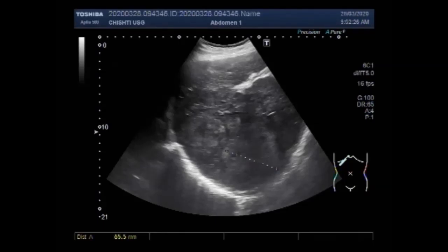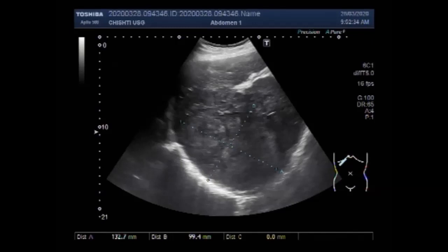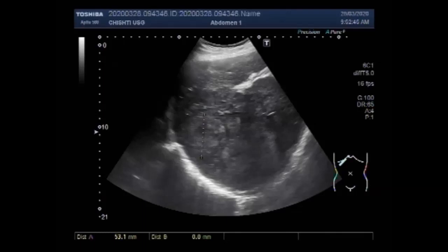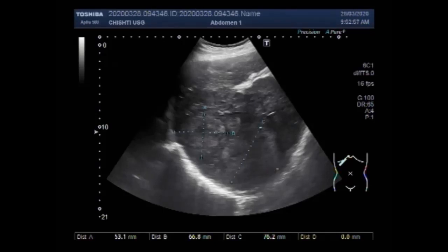You can see it looks to be two masses, but the collective diameter is seen here — the collective size of the mass. This is the size of one mass and the other mass adjacent to it. Both masses are adjacent to each other.